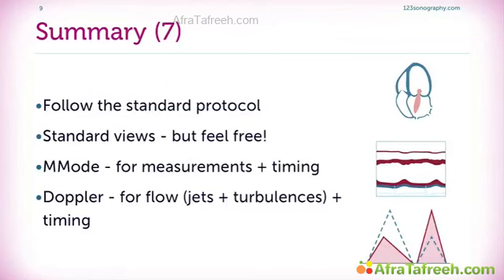In summary, it's also important that you always follow a standard protocol. Start with the parasternal window, then switch to the apical windows, and then perform the subcostal window. Always use all standard views that I showed you, but feel free to also use other views, atypical views, and that you focus exactly on the pathology or the region of the heart that is of interest to you.